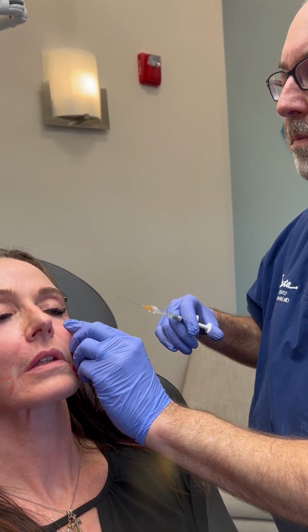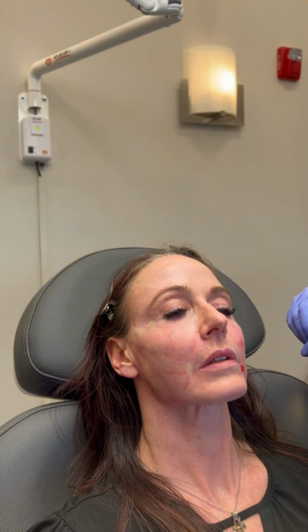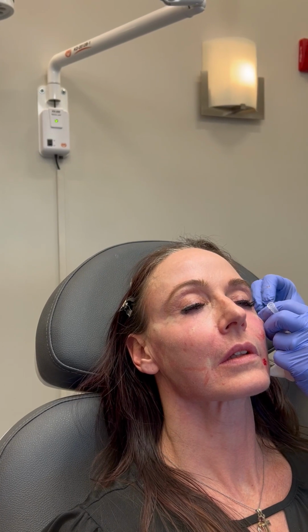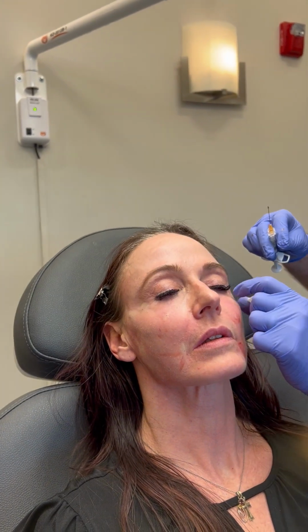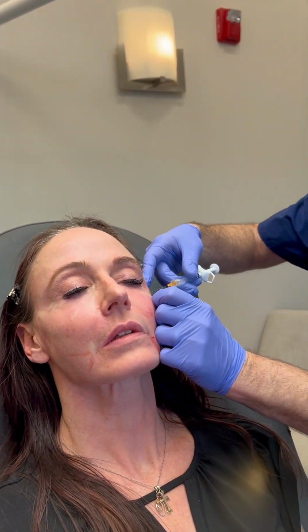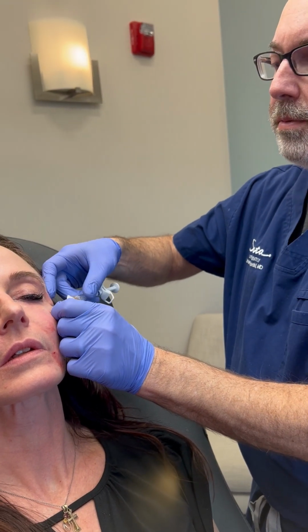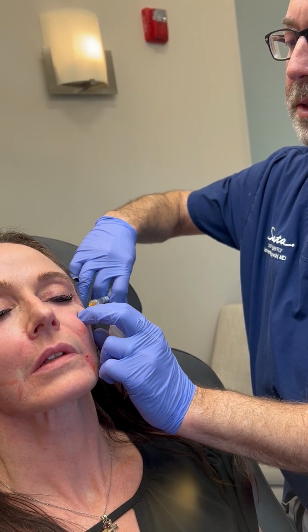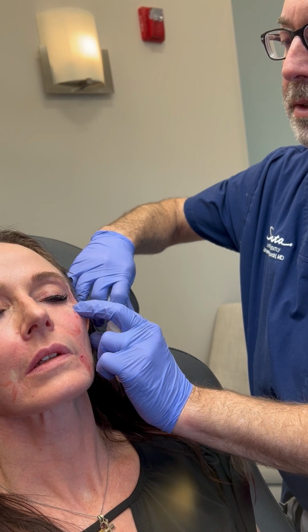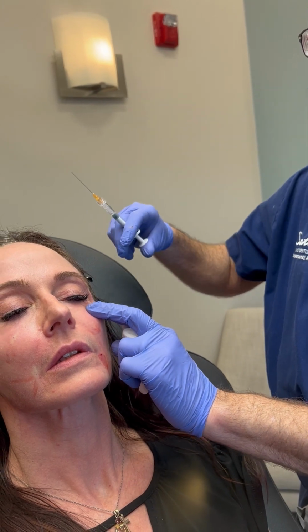Just going to do a little bit here. And then we'll do some on the lateral portion of the under eye. That was just a quarter of our syringe, and our syringe is actually a half a syringe because we have blended it with saline. So we're going to approach from the lateral side as well here, and again just do a little bit in the tear trough over here, in the inferior orbital area.